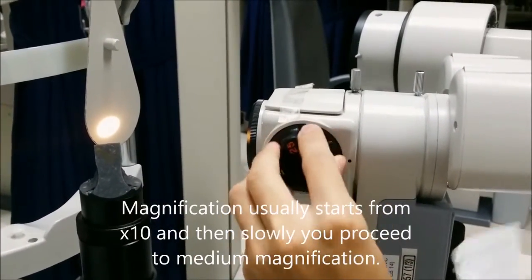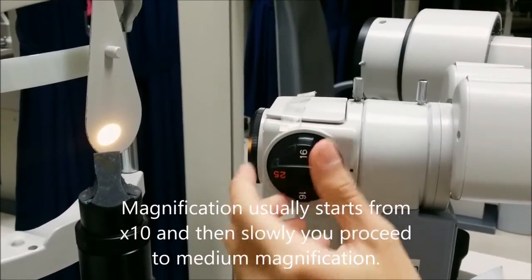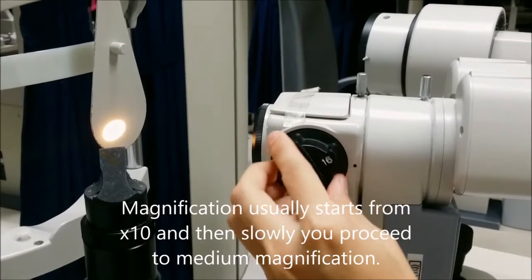Magnification usually starts from 10x and then you slowly proceed to medium magnification.